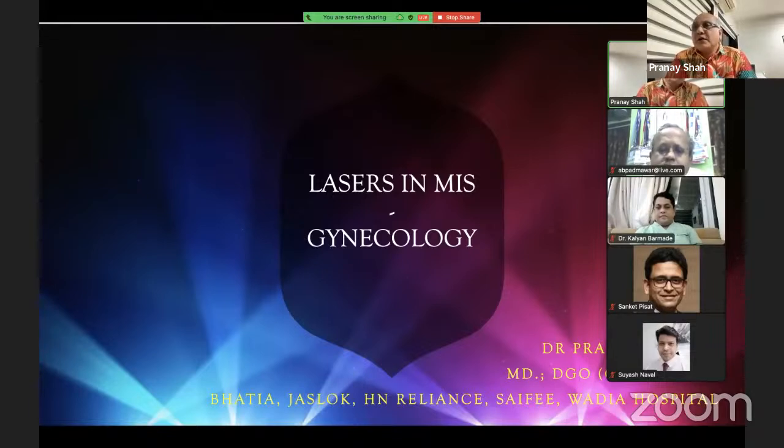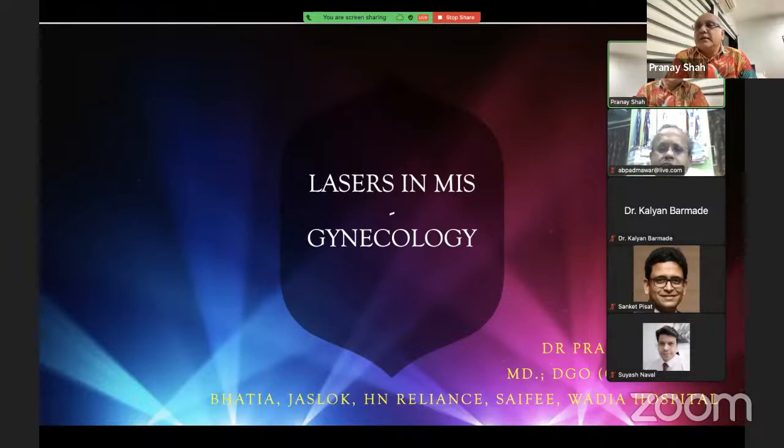The use of laser in gynecological minimal invasive surgery was at its peak in the 90s and 2000s. During the early part of my training in endoscopic surgery, I was fortunate to watch masters like Kamran Nezhat from USA using the carbon dioxide laser and Chris Sutton from Surrey, United Kingdom using the KTP laser. Improvements in other energy sources, mainly the monopolar, bipolar, and ultrasound, which we've already heard from the previous experts, and the high cost of laser led to a gradual decrease in its use. A renewed interest in laser is seen due to technological advances like the new fiber carbon dioxide laser and the dual frequency diode laser.